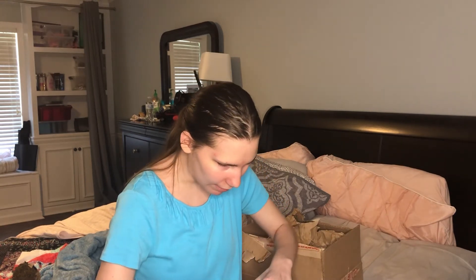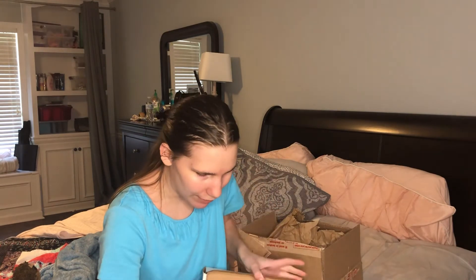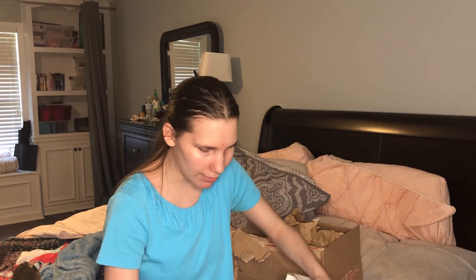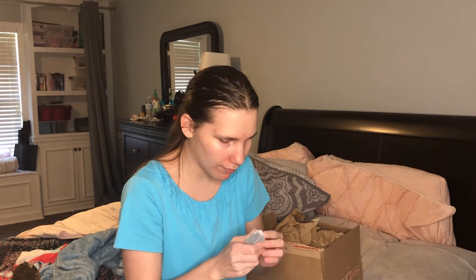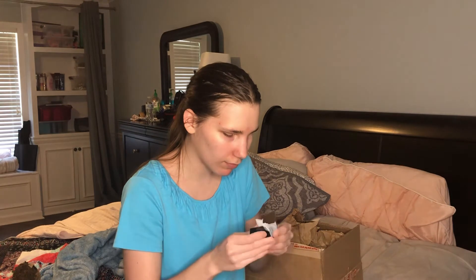Let's open this box. Oh, something just fell out. This is the box for the charger. I opened it upside down — I mean backwards. This is the little box for the charger. Nice.